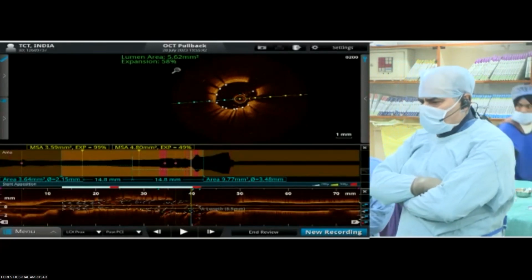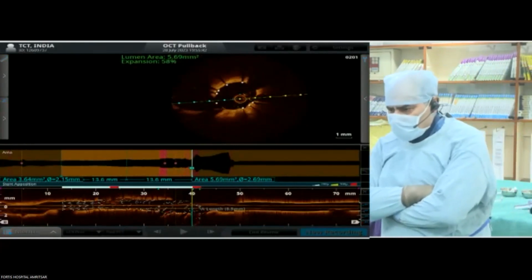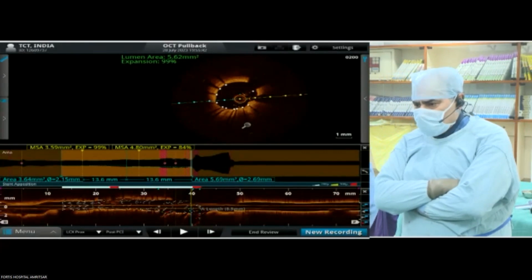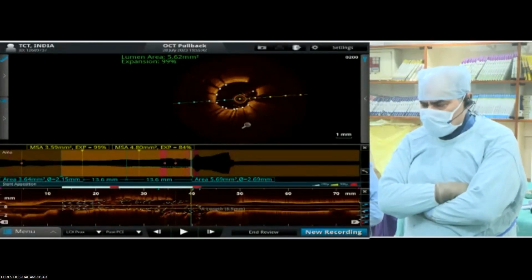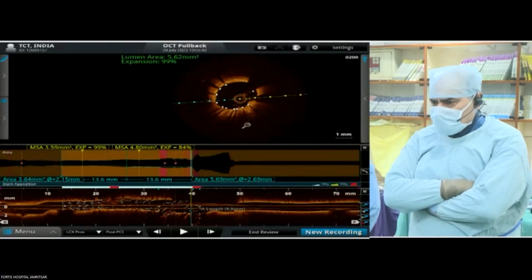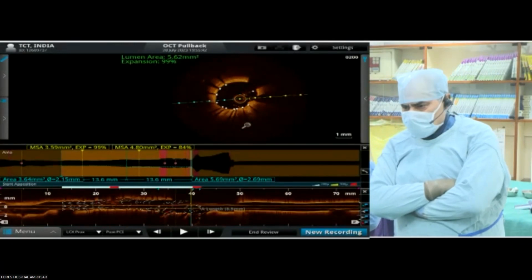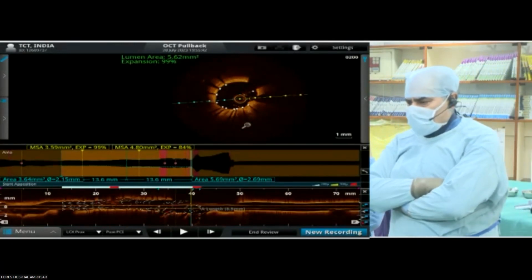The circ ostium is 5.62, to be accepted because it is actually not a large vessel. That was the first comment we made. Since it is not a large vessel, we will go with a drug-eluting balloon. You got a 5.6 area in a small vessel with 2.75. It's okay. So Dr. Arun Chopra, the majority of the vote is to leave it alone now and show us the final answer.